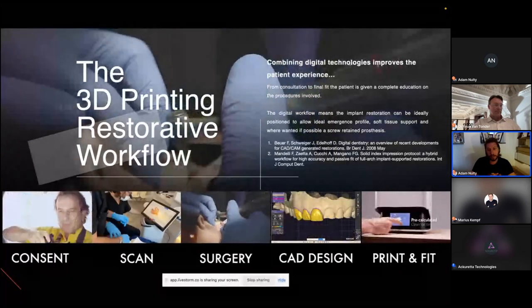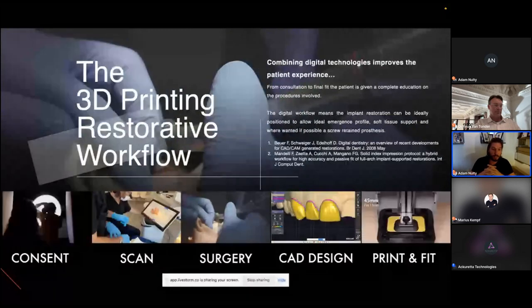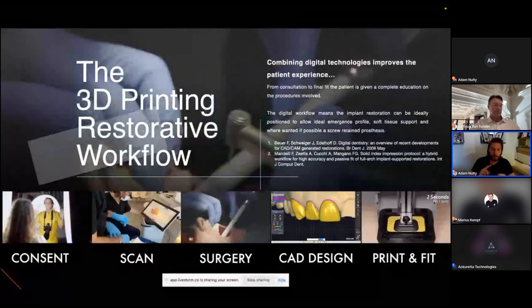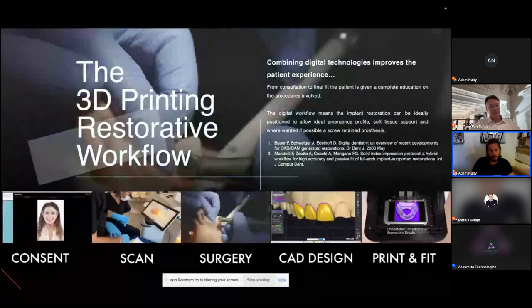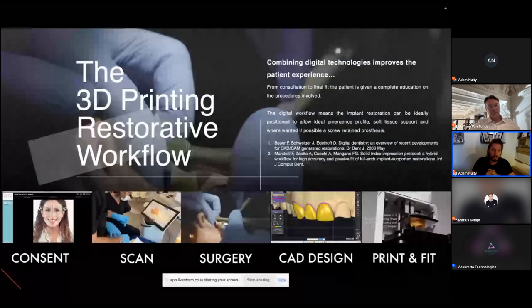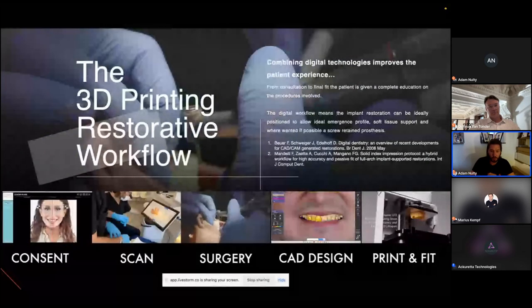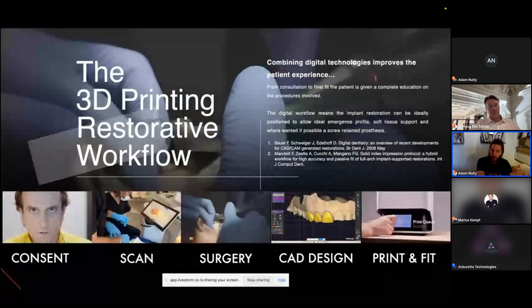That surgery phase, then we can also use 3D printing in with the CAD design phase. We can print the actual restorations. We can print the models that we're going to place those restorations on. But one way or another, those stages will involve printing and fitting those restorations or models or guides that we need to slice, which I leave with Quintus.